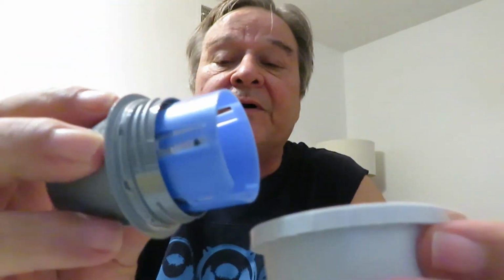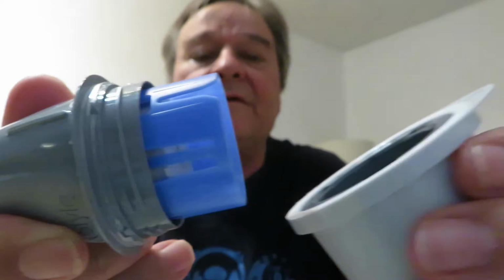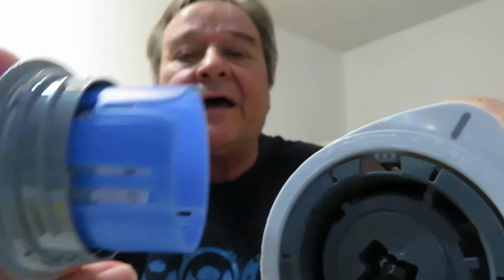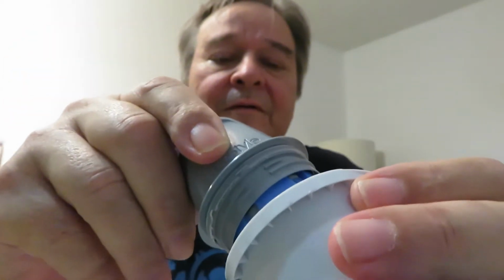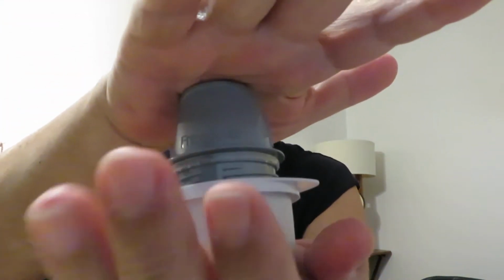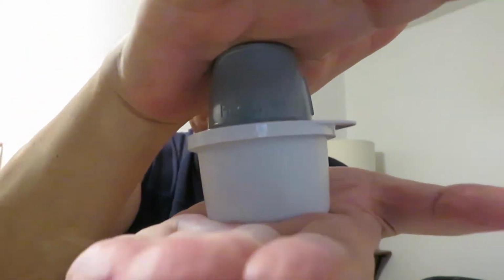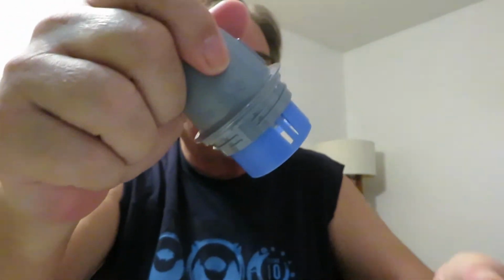So we got these two parts here. Line it up. There's the line. Can you see it? Yeah, that line. And then line it up with that line. See, it's got two lines. Put it in there. Like I said, you can put it on a hard surface, but just press it together. Simple. There's no doubt now that it's in there. Here's the inside of that. When you look, you can see the needle, but I didn't notice it before.